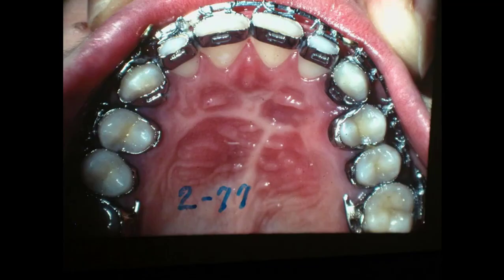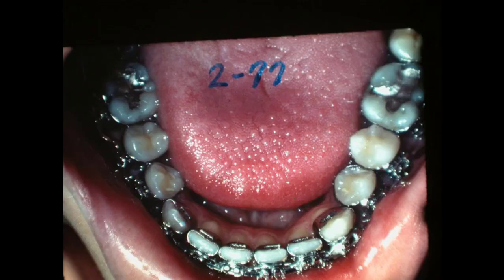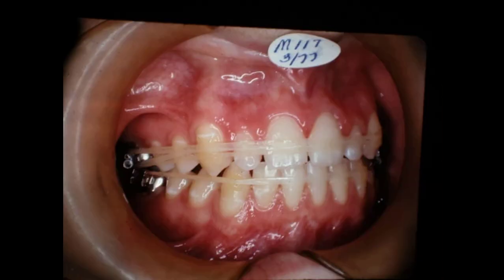There — it's getting pretty close. We've got the space over here; still need some final adjustments. Here it is in 3 of 77, and we started this somewhere in 74, nearly 75.